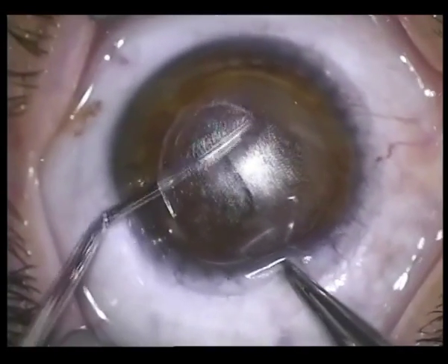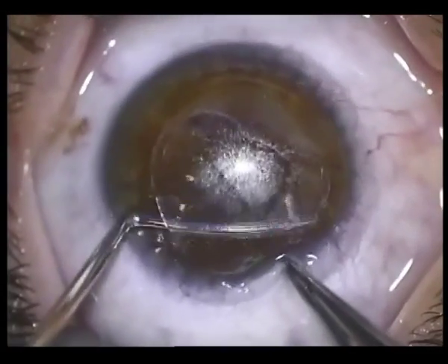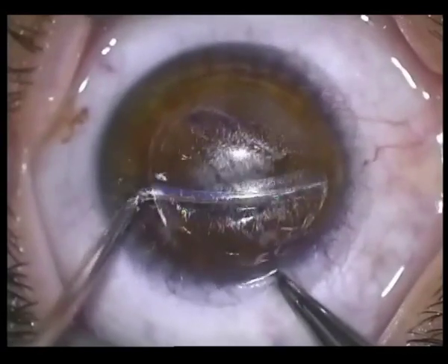The retention of uncut anterior stroma allows for higher myopic corrections than usually restricted by traditional residual stromal thickness calculations.